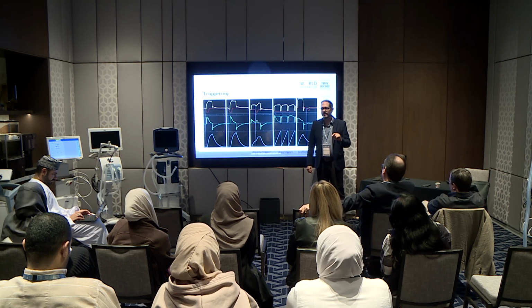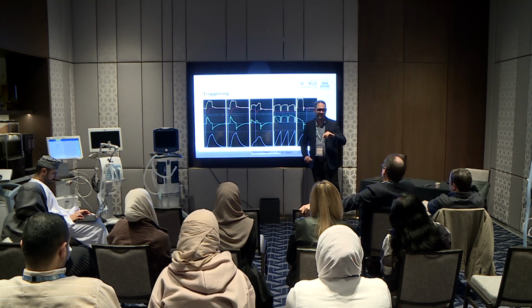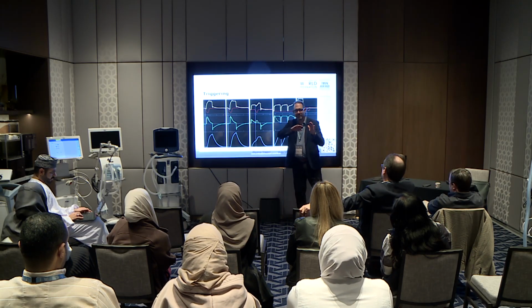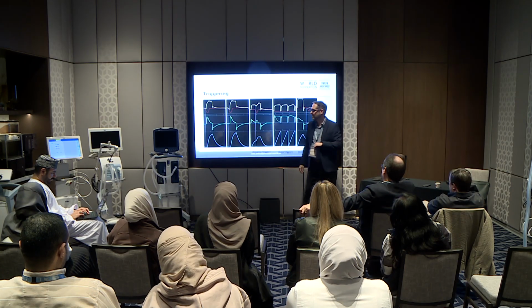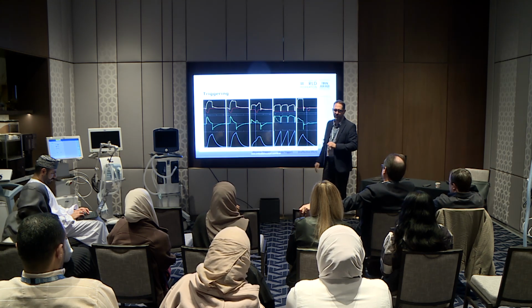There are reports of brain dead patients who were doing apnea testing, and the patient's breathing on pressure support, but there's no brain activity. And it was the heart triggering the ventilator, so it gives the breath. Exhalation occurs as soon as flow reaches 0. You see another breath simply because of cardiac activity. When it's doing this, it's a leak. And your ventilator is likely alarming right now. There's no expiratory flow. It's going to alarm you.